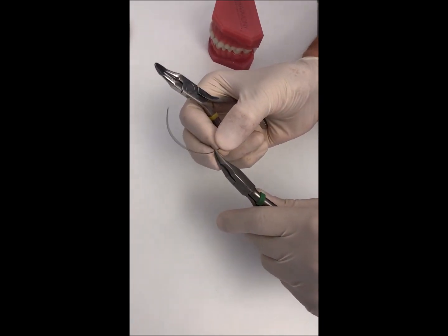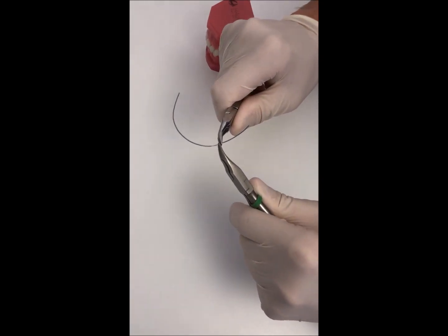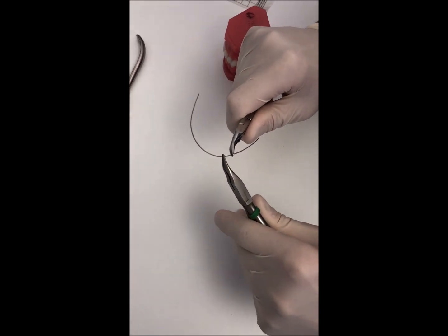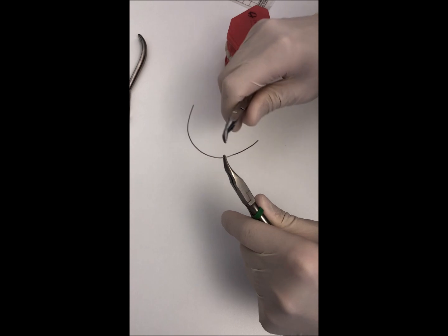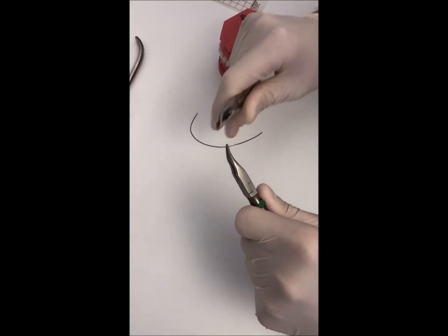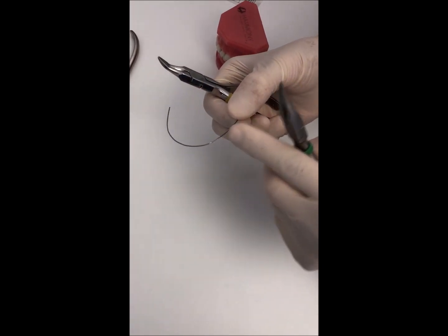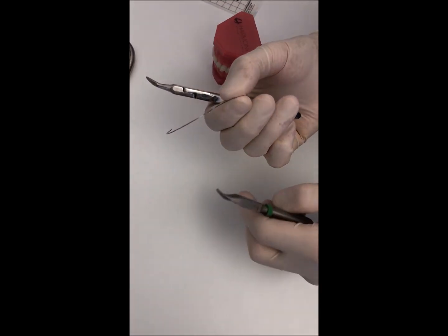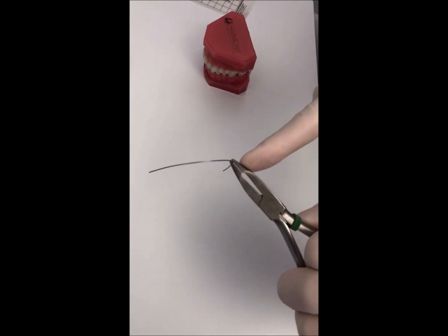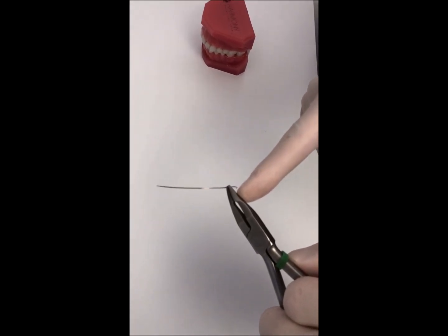If we want to provide some more positive torque, we have to go a little bit more with the plier inside. This is a positive torque. Then we place the plier again and compensate, putting the mesial and distal parts of the wire on the same plane. The amount of activation is around 45 degrees of torque activated.